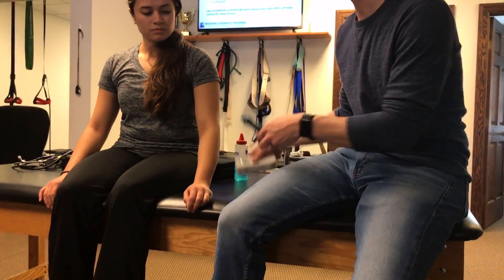When I'm taking Doppler — you can hear that right now — I'm not so worried about having supported legs, supported arm, etc. I do want the patient to be comfortable though. I don't want them to be clenching or doing something that could change the Doppler. It really likely won't, but something like this is perfectly fine.